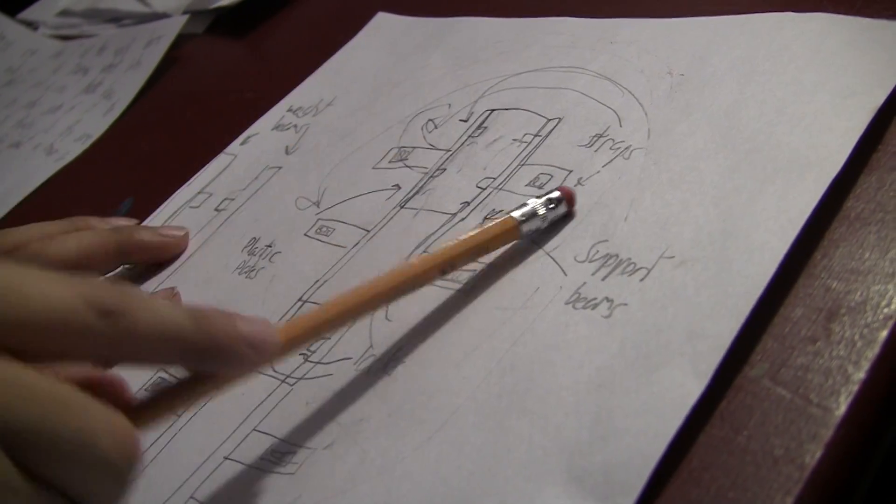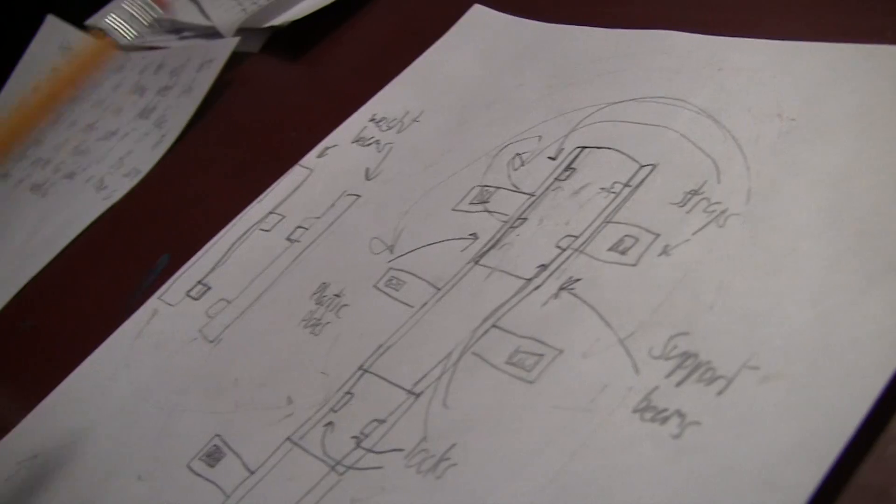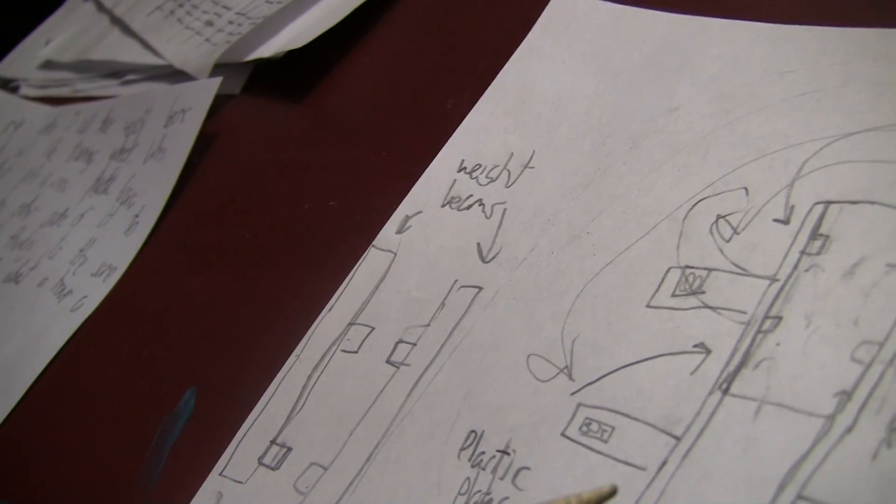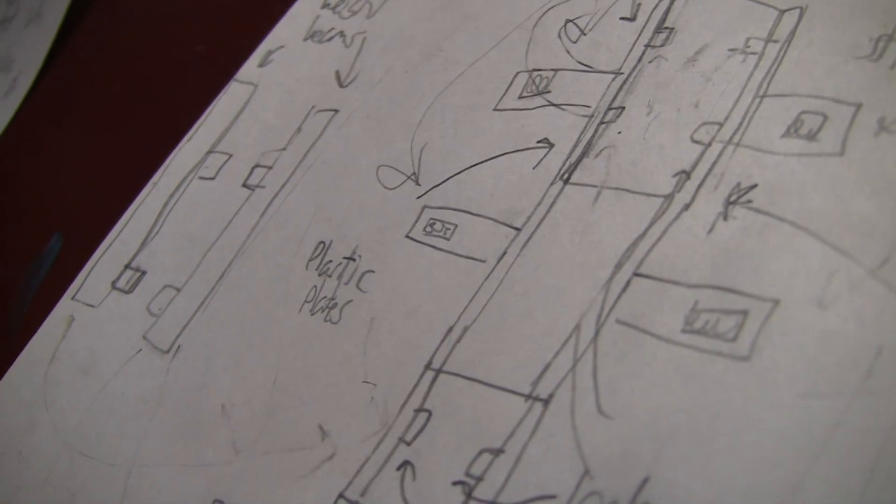This represents a plastic brace. These are the two top velcro straps. These are the white beams, and they attach onto — maybe this one goes here, locks in, locks in, and this one goes here, locks in, locks in. This will help the 10 million polio survivors around the world.